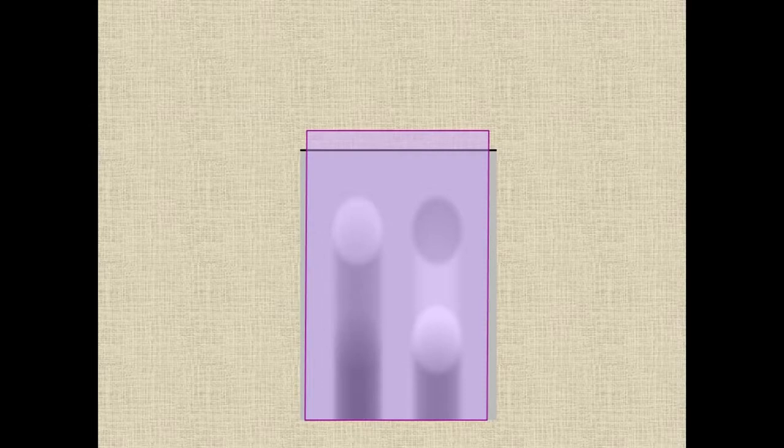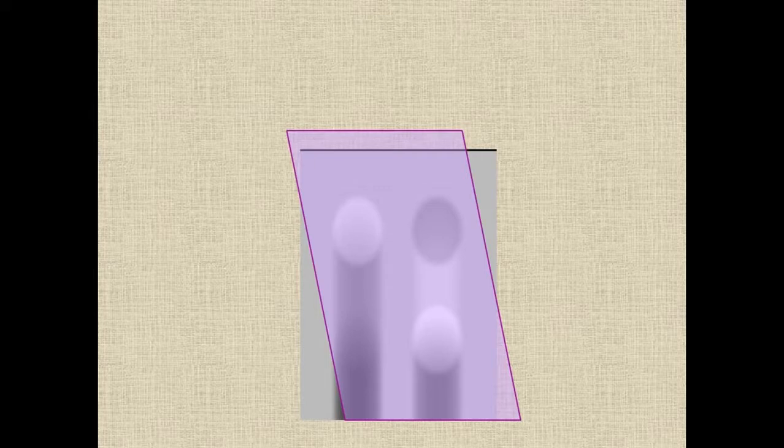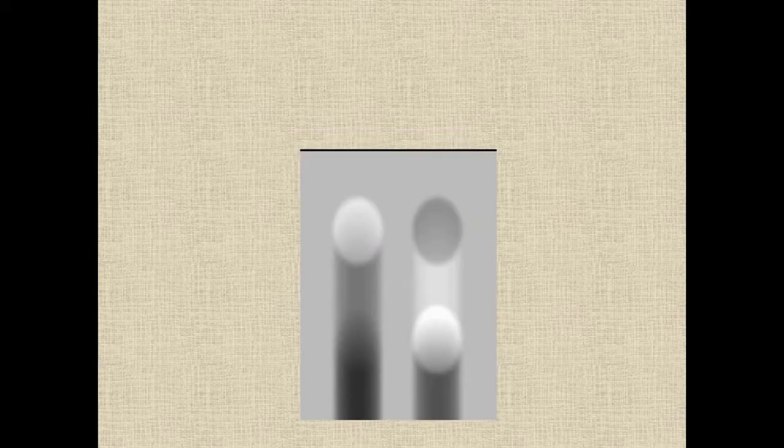Multi-beam technology means that the same ultrasonic probe will interrogate the tissues from slightly different angles, such as here, and here, and these slightly different images are added together to produce a compound image which are generally of much better quality than the single beam technology. If your machine has multi-beam technology, it should invariably be switched on.